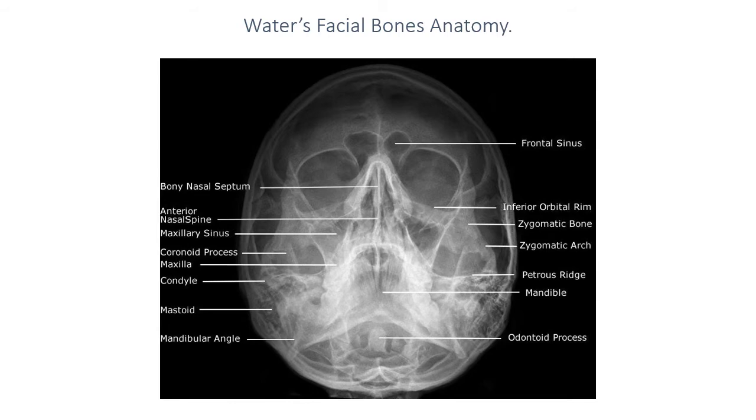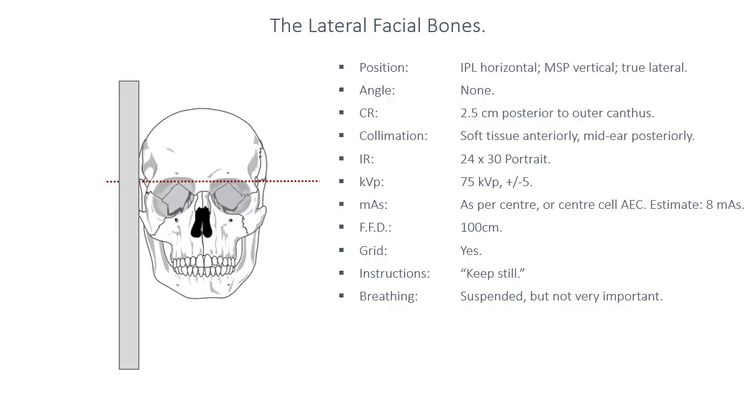You can see in front of you there some of the anatomy of the facial bones, just to be able to maintain your knowledge base of facial bones radiography. Let's now move on to the lateral facial bones projection.